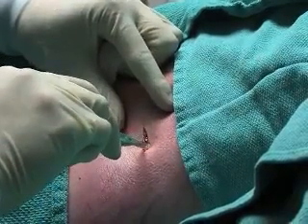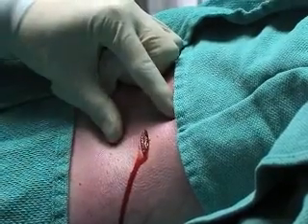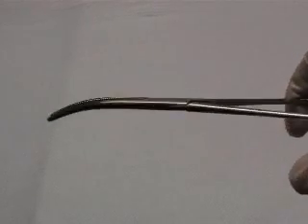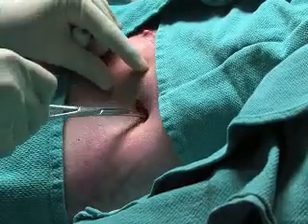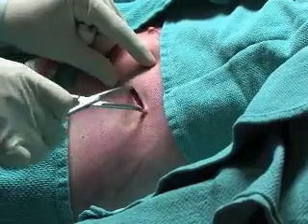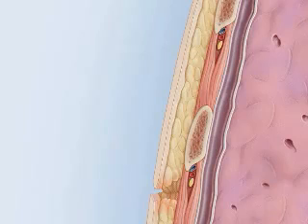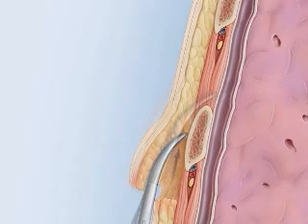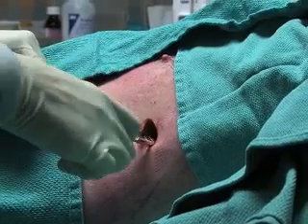Make an incision approximately 1.5 to 2 centimeters in length above and parallel to the anesthetized rib. Introduce the curved dissecting instrument, such as a Kelly clamp, into the incision. Begin dissecting the subcutaneous tissues in order to reach the intercostal muscles. After dissecting through the subcutaneous tissues, stay on top of the rib to guide the blunt dissection. This will create a diagonal path towards the correct intercostal space.